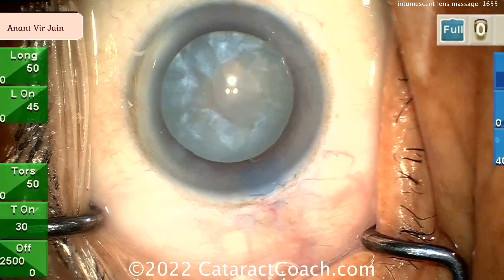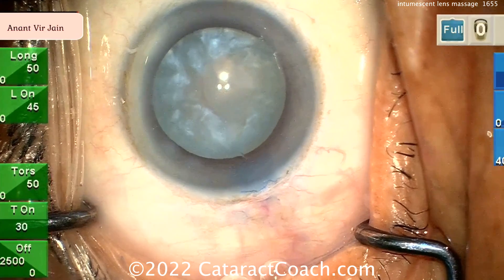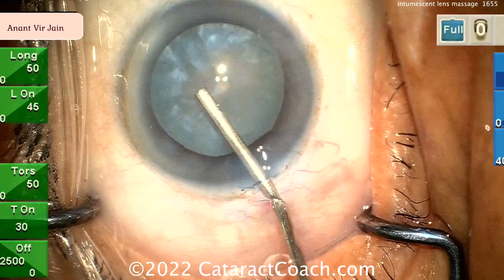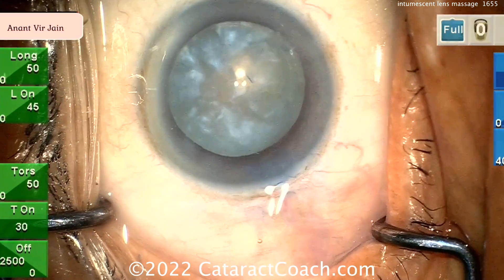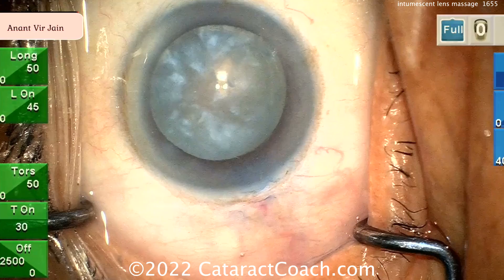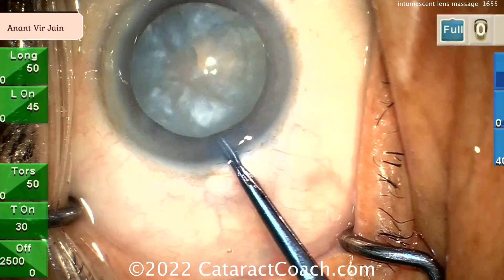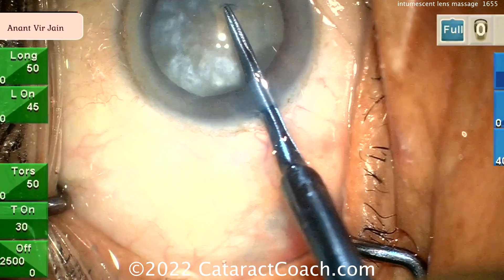You can free up any loculated pockets of liquefied lens cortex, because that can cause pressure behind the lens nucleus. Once that massage is done, you've spread around the fluid and hopefully released the tendency for an Argentinian flag sign — or that posterior pressure pushing things forward.